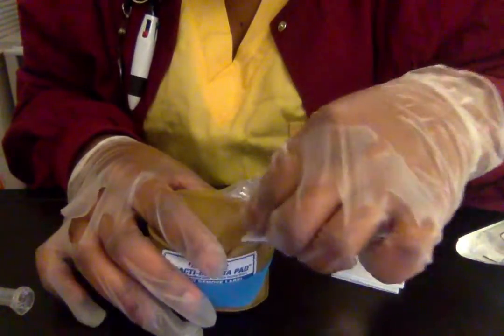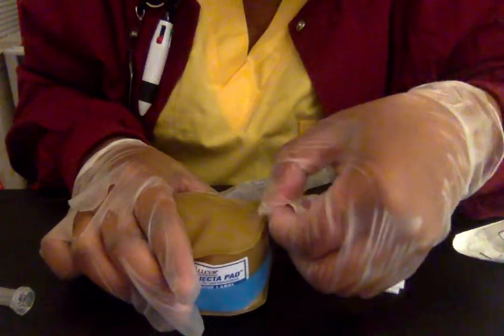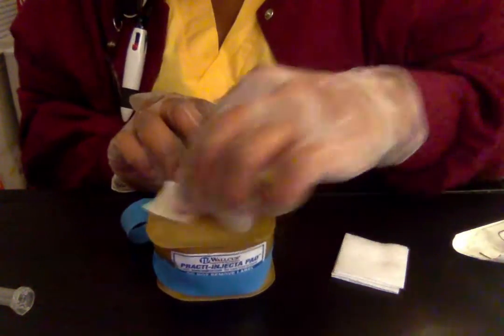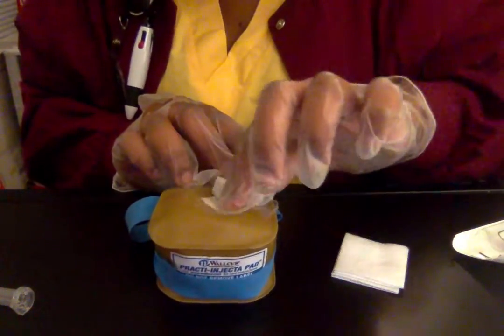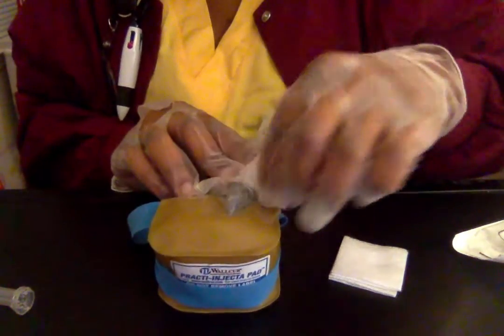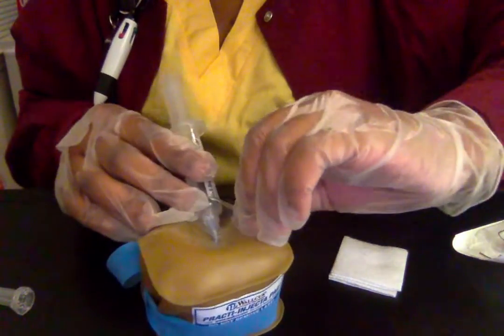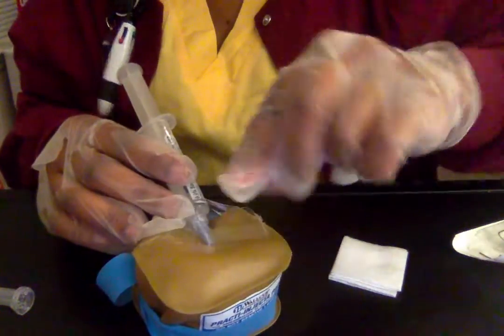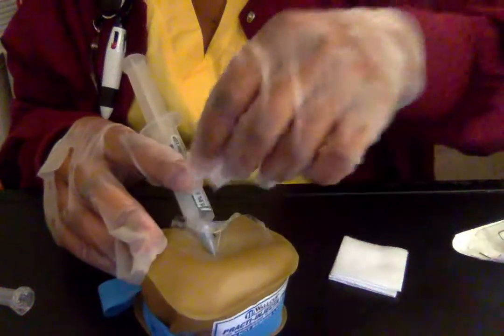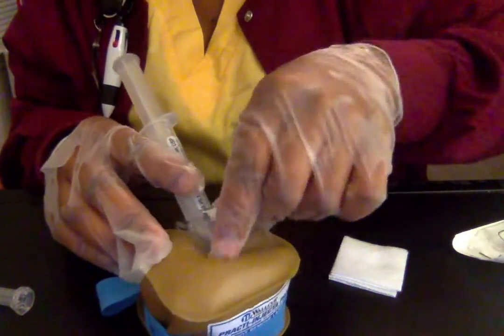Be gentle, but at the same time rough enough to get it off. When we are DCing an IV, we always want to pull down, because we don't want to forcefully pull that IV out. When we're pulling that tape off, we don't want to accidentally rip it out. So we make sure we're pulling down to where the IV won't come out.